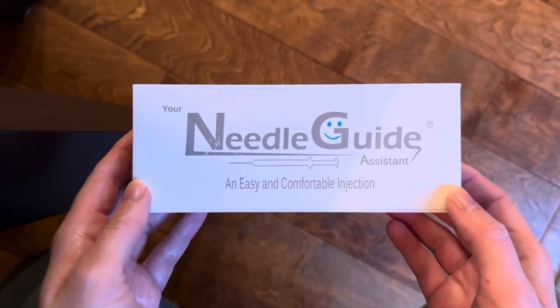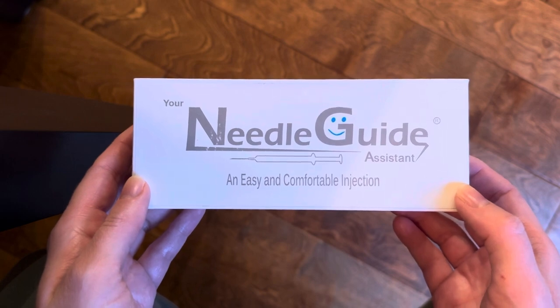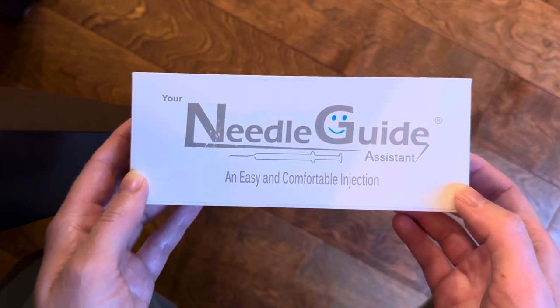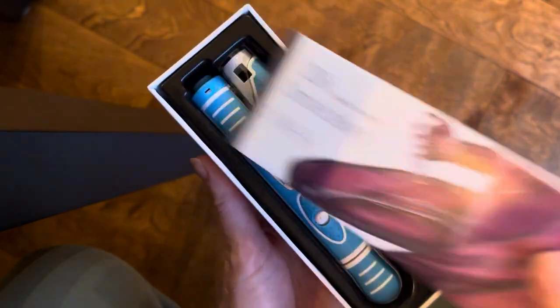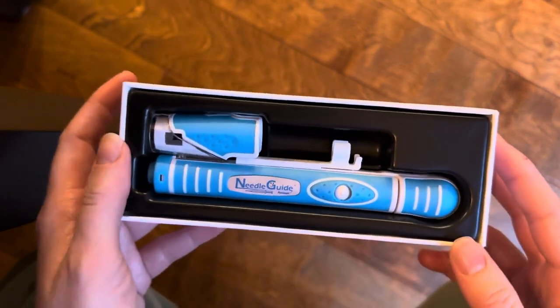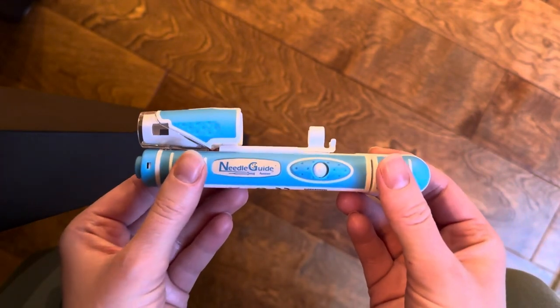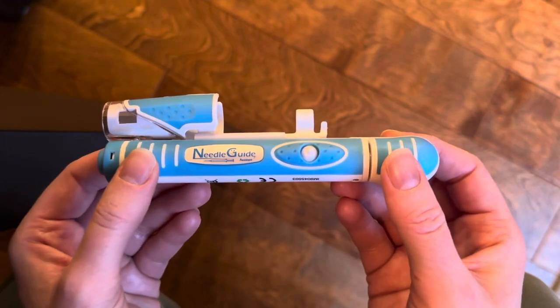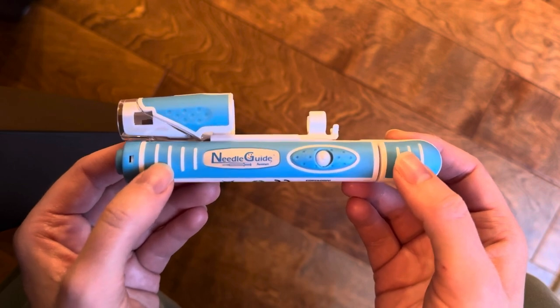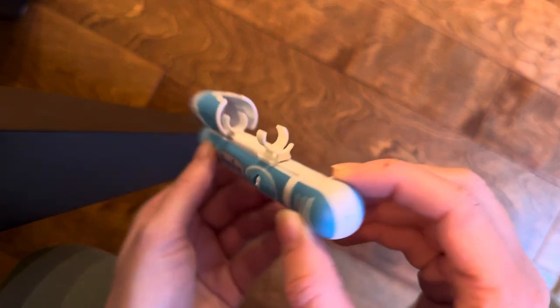We're going to talk about the auto injector. The auto injector I purchased and used through IVF was from Union Medico — it's the Needle Guide Assistant Super Grip. They come in various sizes, so make sure you're ordering the one that appropriately matches your syringe size. They come in 0.5 ml to 5 ml syringe sizes, as well as 4 to 40 millimeter needle options. I purchased mine in blue — there are a couple of different color options. This cost me about a hundred dollars; it's sold in euros on Union Medico's website, so the conversion is about ninety-seven dollars.